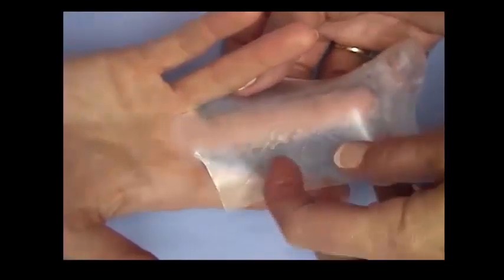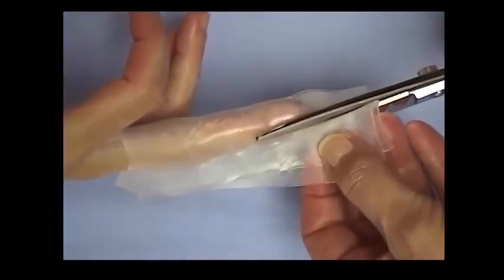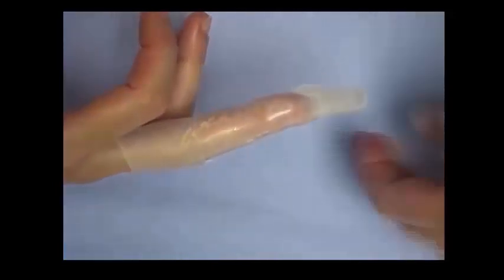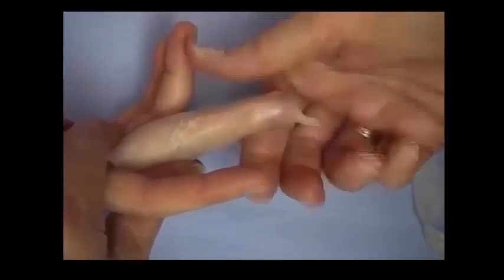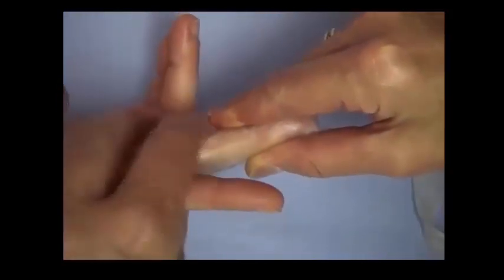With the material heated thoroughly, it is quickly applied to the volar aspect of the finger and pinched together dorsally. Don't spend too much time doing this or the material will cool. Scissors then cut this close through the material. Now that the material is being held in place by its own memory, I'm able to hold the finger in full extension while the material cools. You can press over the dorsum of the PIP joint as that area will be eliminated, but smooth out any pressure on the palmar aspect so that pressure is well distributed. The material is pulled so that it covers the entire tip of the finger.